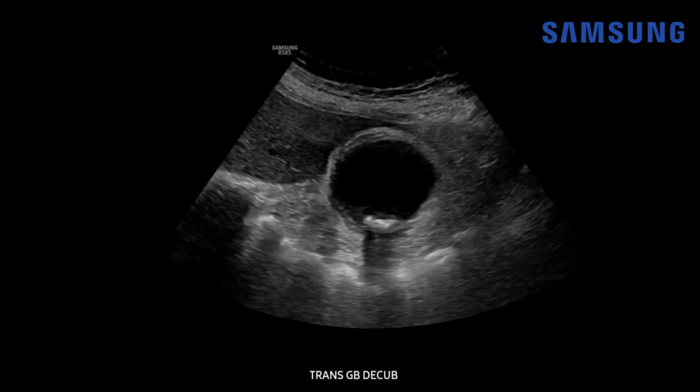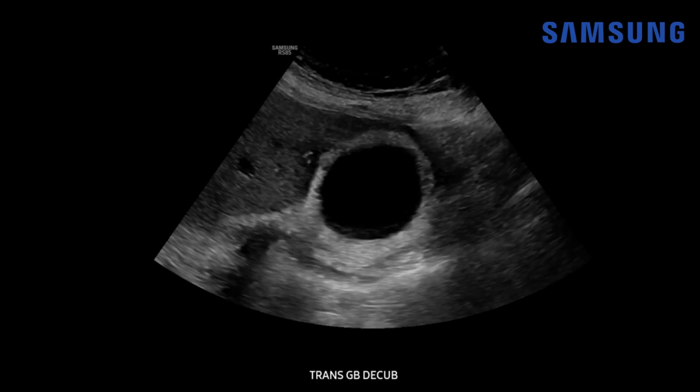Let's turn transverse, and now we're seeing more of a layered edematous appearance within the thickened gallbladder wall. Here's that gallstone again with post-acoustic shadowing. And let's measure the diameter of the gallbladder, and it measures about 5 centimeters.